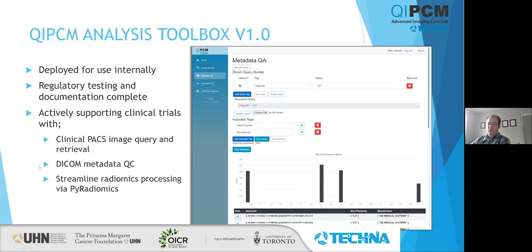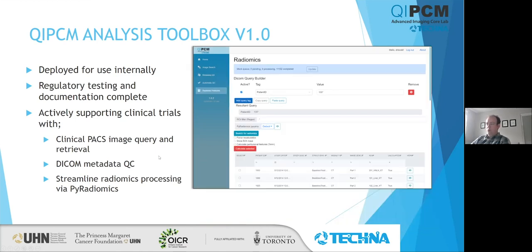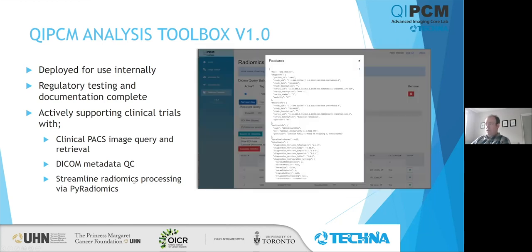Another feature is our QA and QC. For metadata QA, it allows us to do a deep dive into the metadata of the DICOMs — for example, we can look at the slice thickness used and say we don't want any patients with a slice thickness of five millimeters, that's too large, and crop those out of our selection. So we don't actually use those for radiomics processing. For radiomics processing, we streamline the pipeline using PyRadiomics, which is a commonly used platform. We can go through our PACS, find all the different RT structs, query them up, and send them through for analysis, then export all the different features to users doing that research.